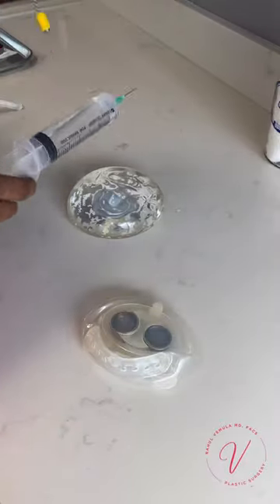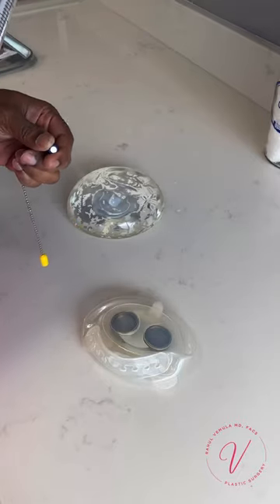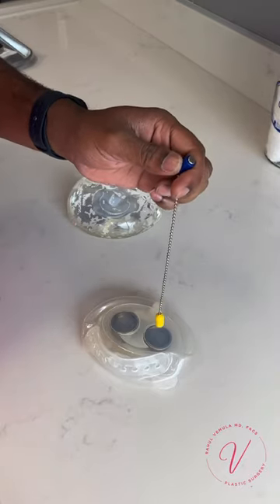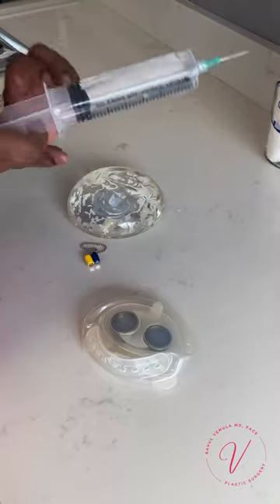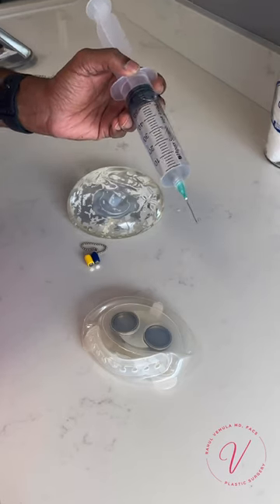Once the tissue expander is in place, I close up the incisions, then my patient comes into the office every week. We find the tissue expander by using a magnet to locate the magnetic port. This magnet would go on a patient's skin to locate where the port is, then I fill the expander with a salt water solution called normal saline.